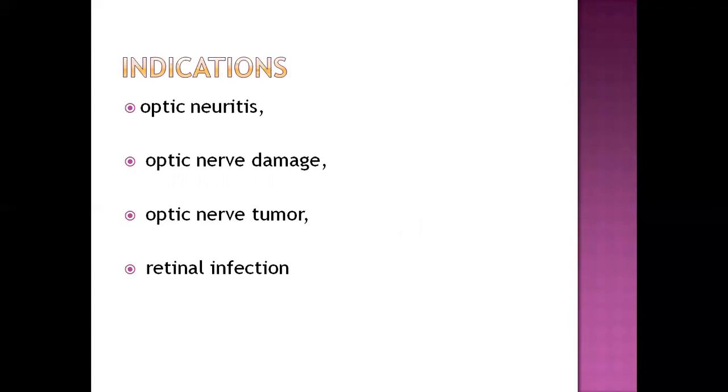Indication. Patients who need this test. Indications are patients suffering from optic neuritis, optic nerve damage, optic nerve tumor, and retinal infection.